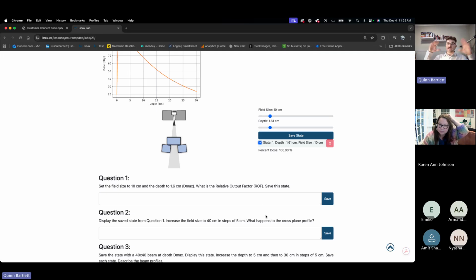And so this is how our entire platform works together, right? You get that initial lesson with the instructor. Let's go over one energy. Let's do it a couple different ways. Now go do your exercise. Go do it with different energies. And now you can access that platform anytime, any place, and not have to worry about real machine time or breaking machines or the stress of the clinic.